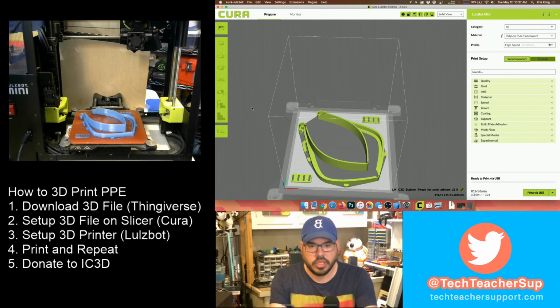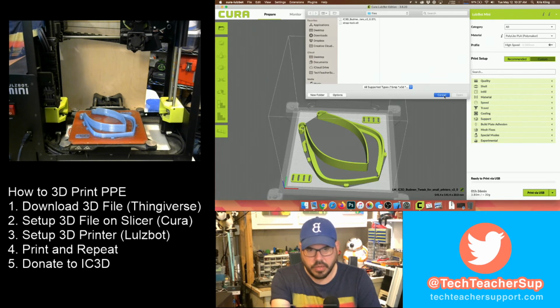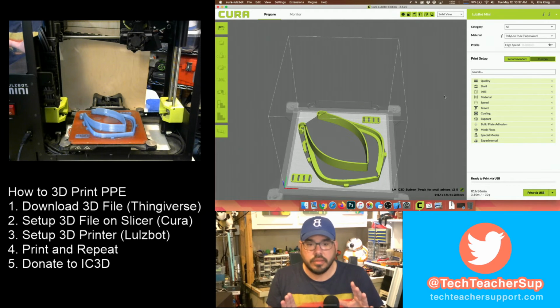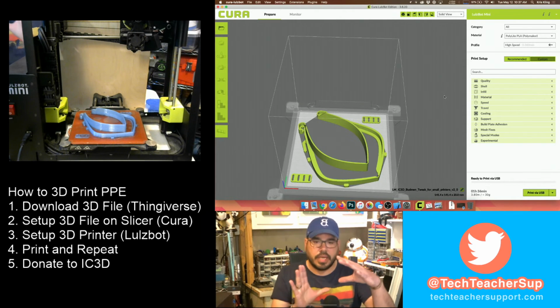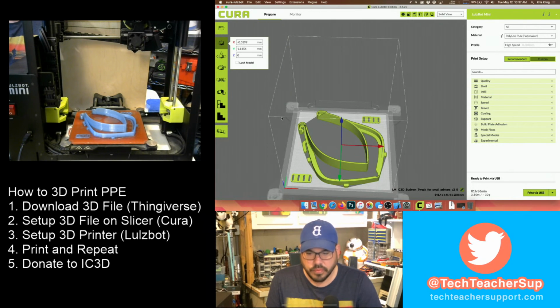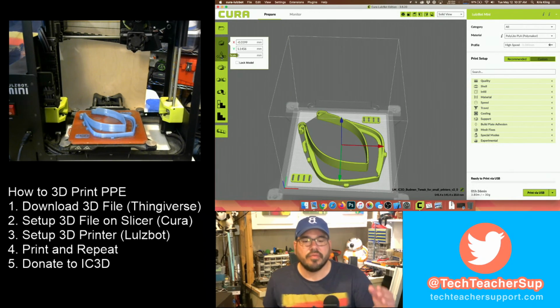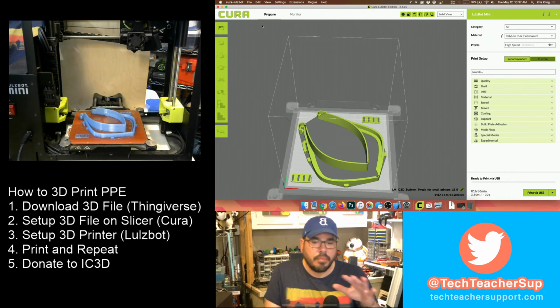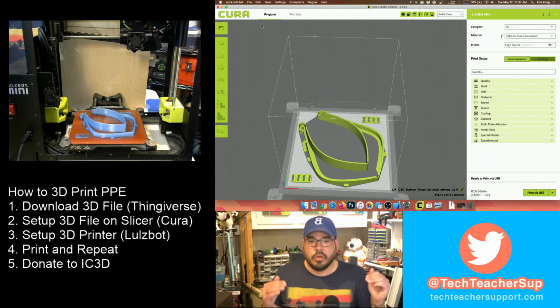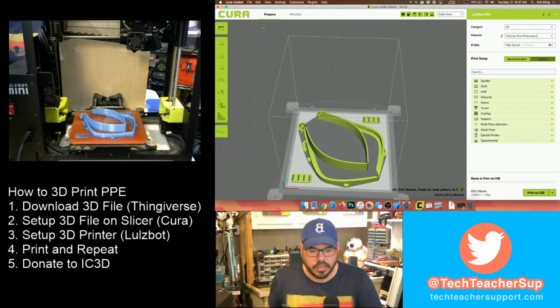Here we are. We launched Cura, we opened the files, and we put them here on the print bed. You may need to rotate them or move them around depending on where your print bed is and how it places it. You know, again, you can grab this and you can move, you can rotate, however you can get it to fit. All right. And if you want way more in-depth on all of this, you can see part 1. And again, that's about a 2-hour video where we go into real detail about all these things.